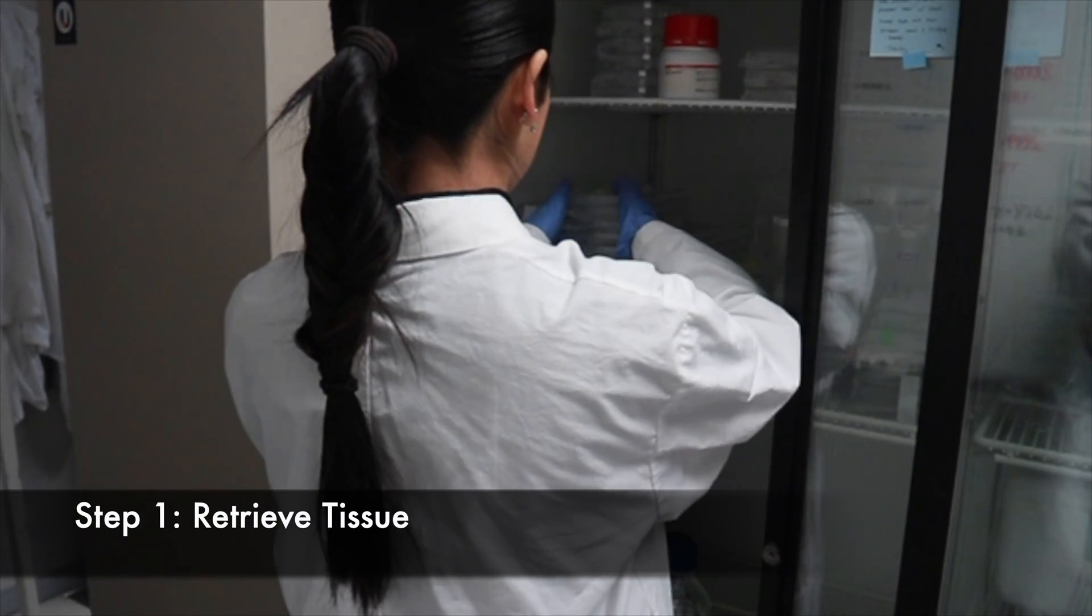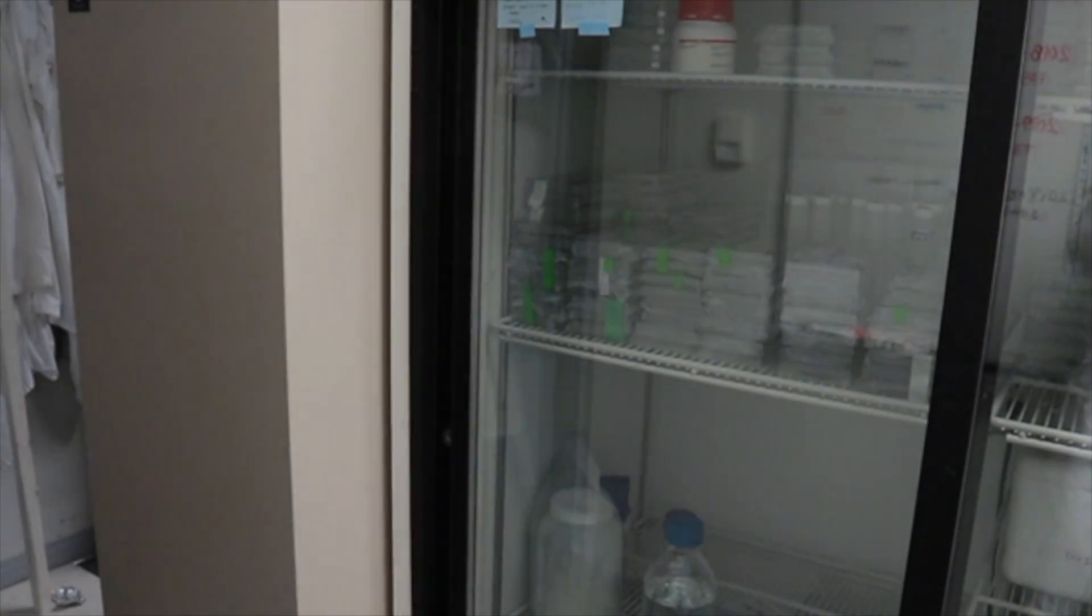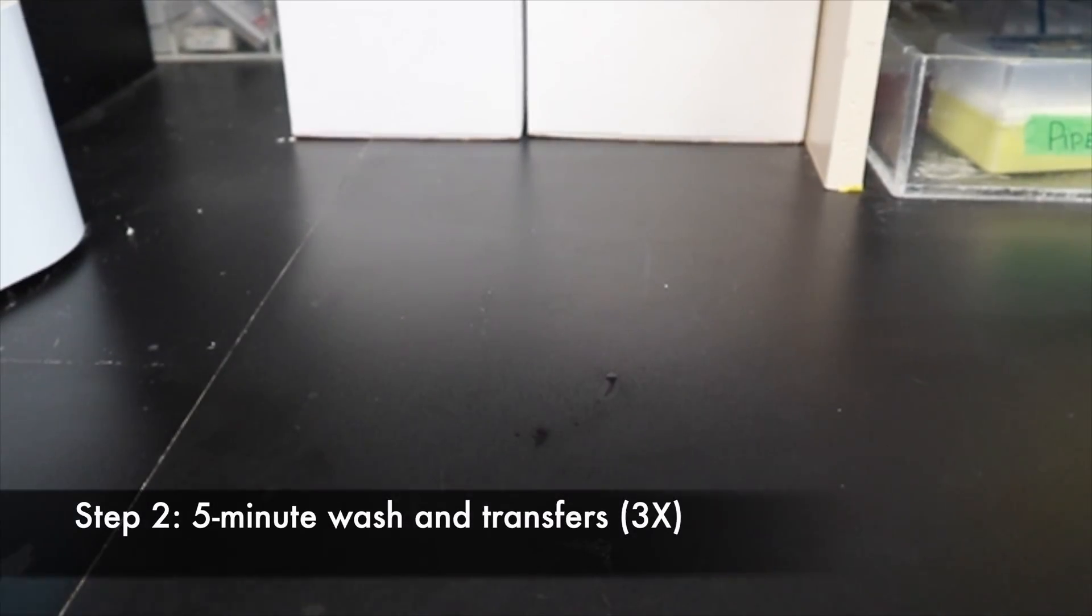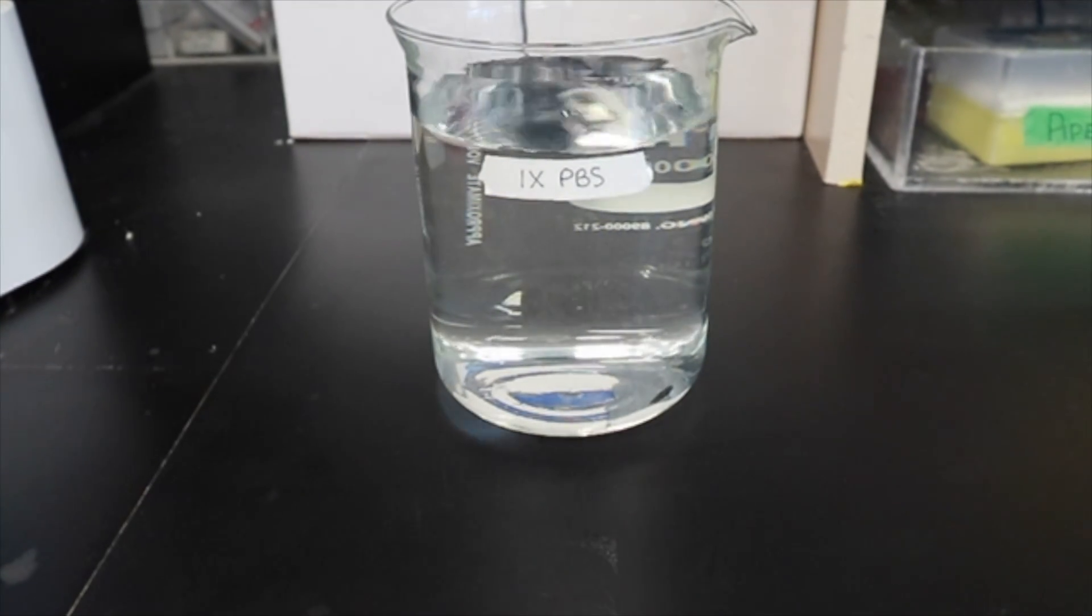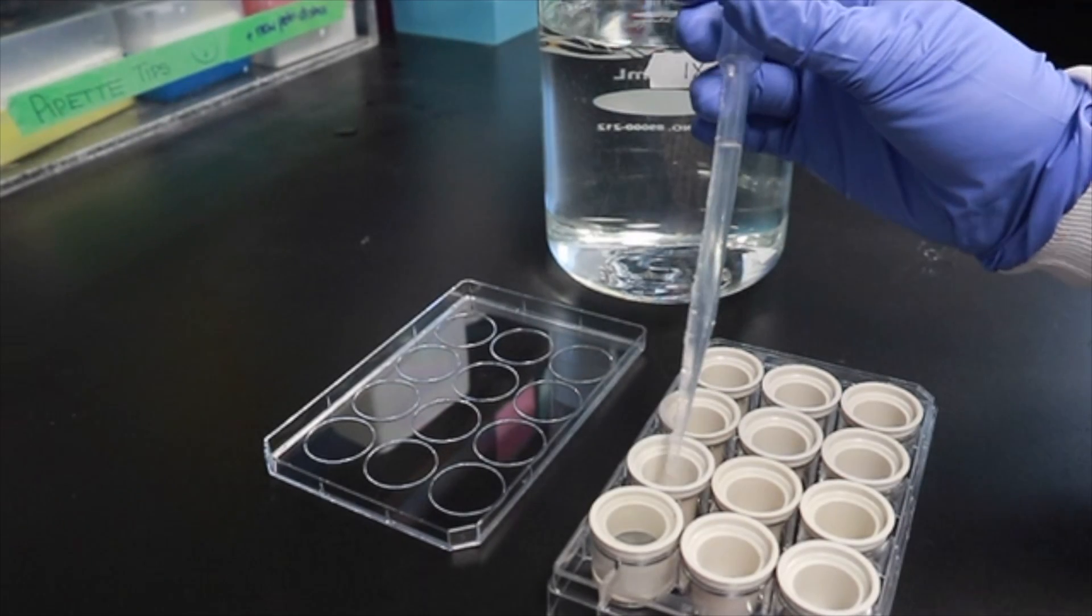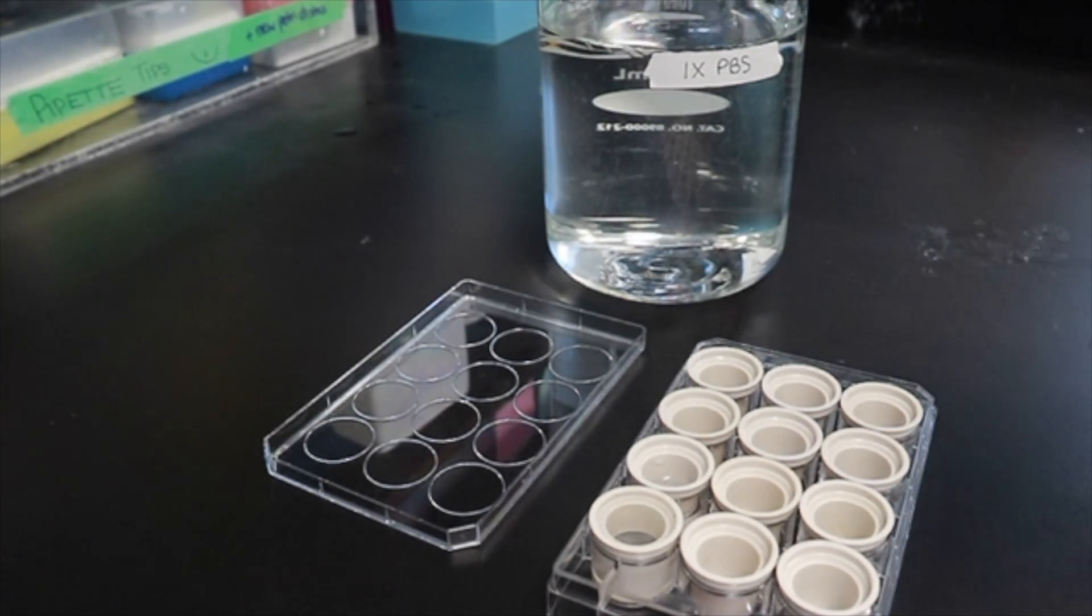To start the staining procedure, retrieve your tissue from its long-term storage. We are using 50-micrometer raw brain sections. In the next step, we will be using 1X PBS, or phosphate-buffered saline, which is an isotonic buffered salt solution used to wash cells, remove unbound reagents, and increase the clarity of your stain.